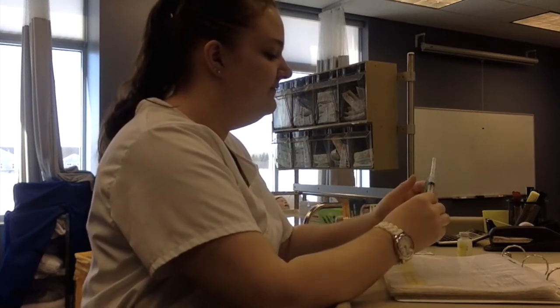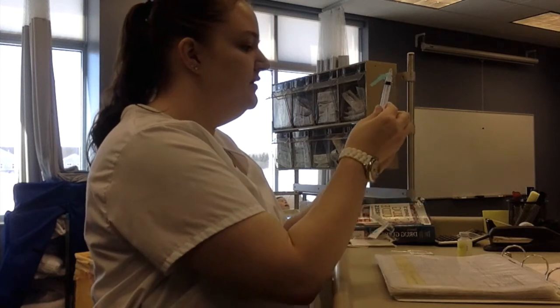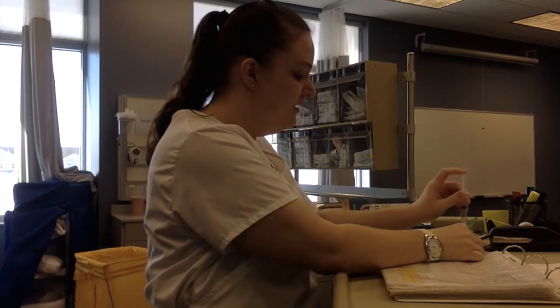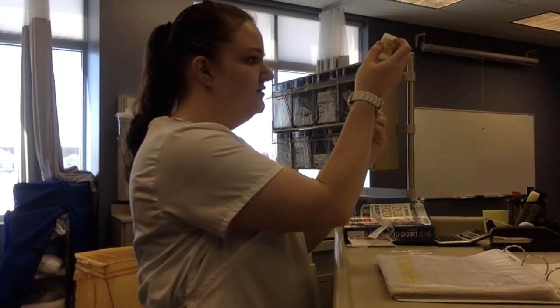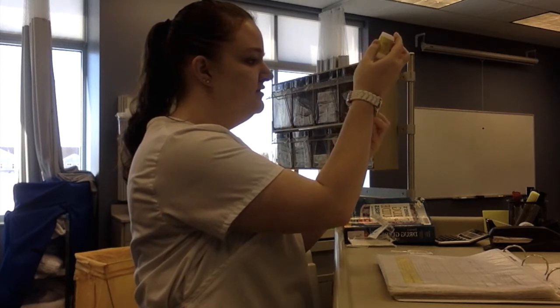I would pull back the safety and uncap my needle. I would draw back 2 milliliters of air, place it into my vial, which has already been cleaned off. I would inject the air and invert. And then I would pull back 2 milliliters of liquid.